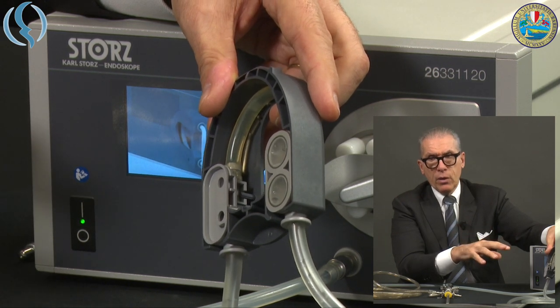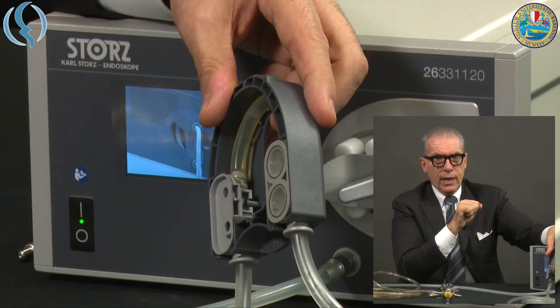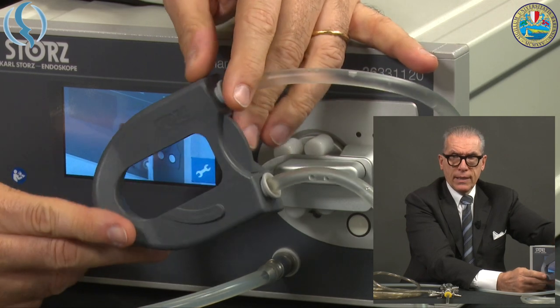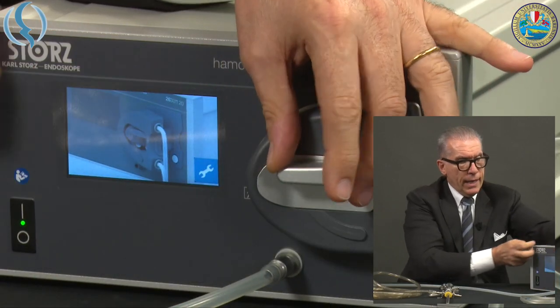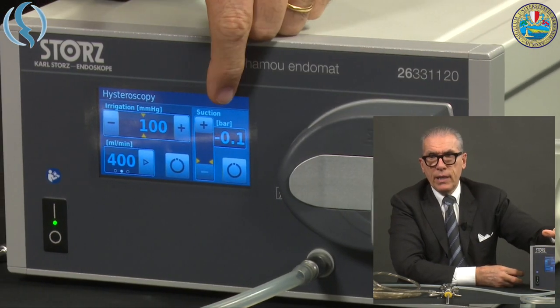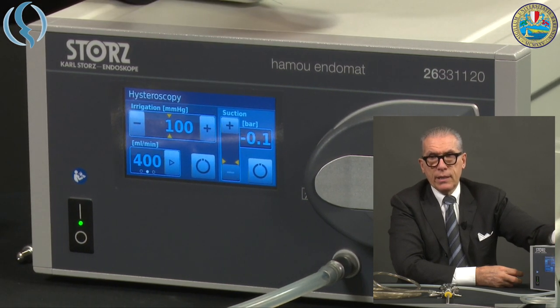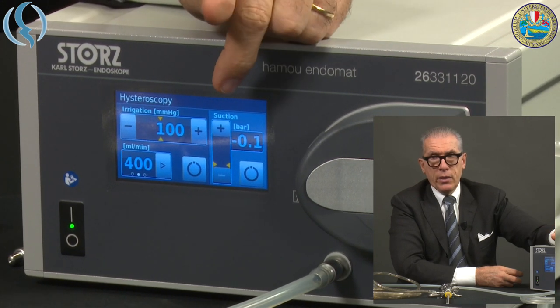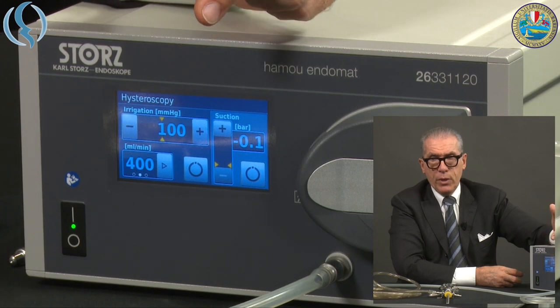You should have one tubing set for hysteroscopy as well as one dedicated to laparoscopy. They are immediately recognized by the machine due to internal differences. If you only have the plastic part, this is inserted in this way — click it in and then secure it. The machine is ready and the setup parameters immediately appear on the screen.